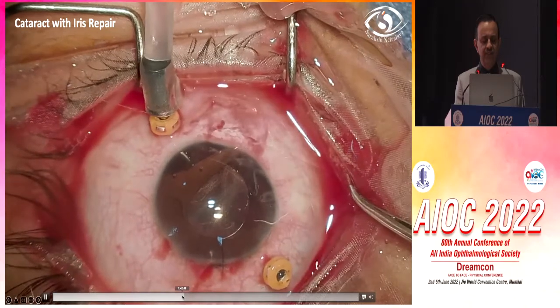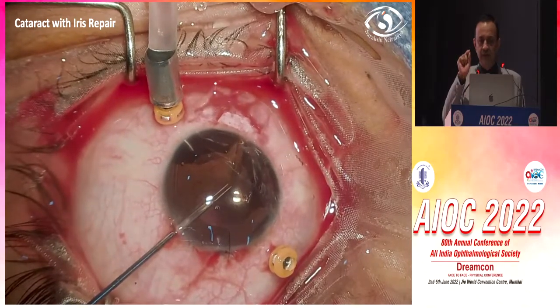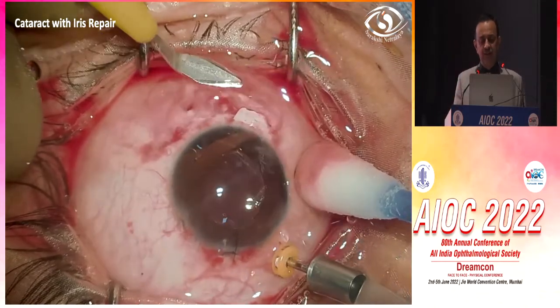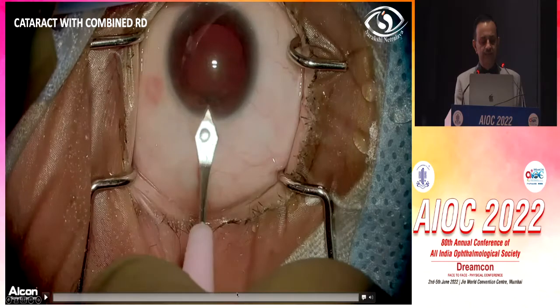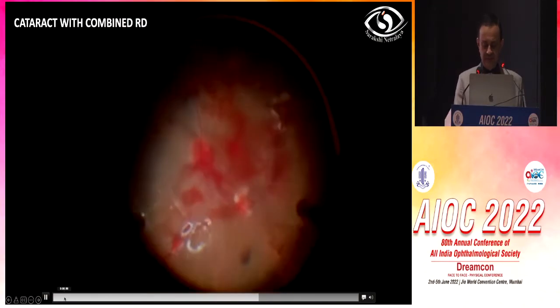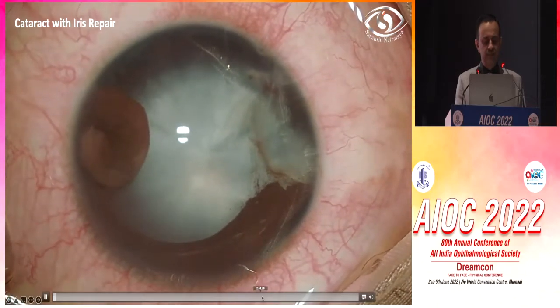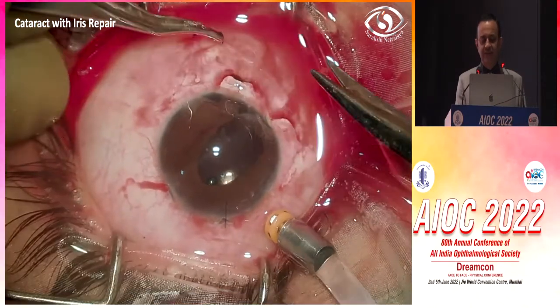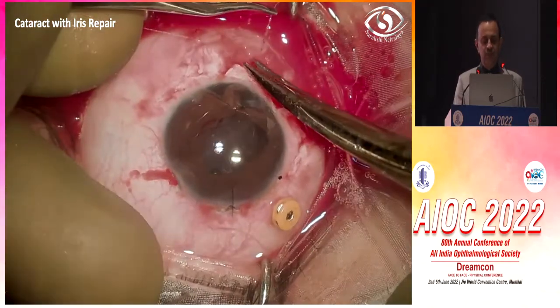So one suture is taken. With such a big field of view, all these complicated steps are possible, with a simultaneous view of the anterior chamber as well as the peripheral field, as sharp as possible. Now I am hooking over here, the second suture goes here. I will just show the conclusion of this part of the case, and you can see I could construct a pupil over here. At the conclusion we had a good pupil, so the patient would naturally have less chance of dysphotopsia and glare and all those things.